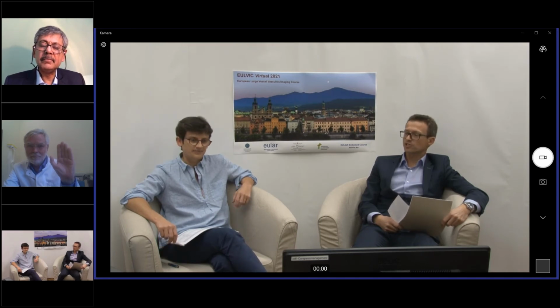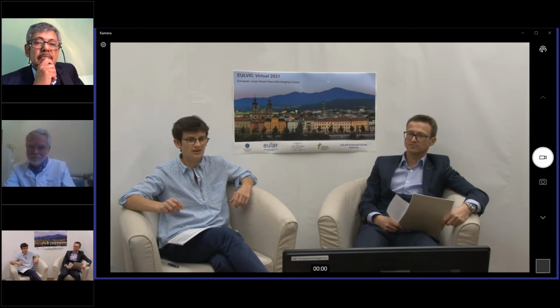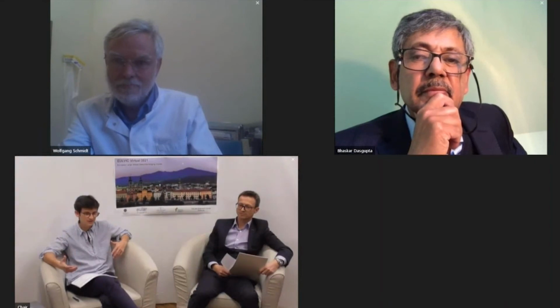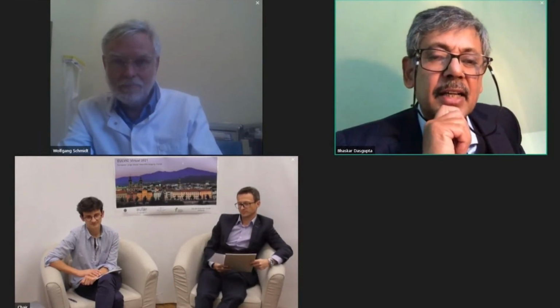Christina, I think we have some questions in the chat. Yes, we have a couple of questions. The first question was, Bhaskar, how long does it take you to evaluate the vessels by the halo score? 15 minutes, for the 8-vessel scan. The big problem, Christina, is that I work in the national health service, so they won't allow us to scan for hours and hours. But the average is about 15, maybe 20 minutes. And I would say that in 20 minutes, you can get a very decent 8-vessel scan, and sometimes the facials as well.